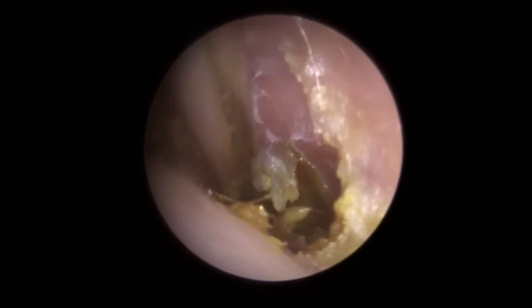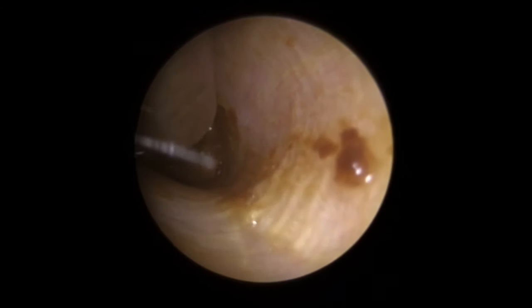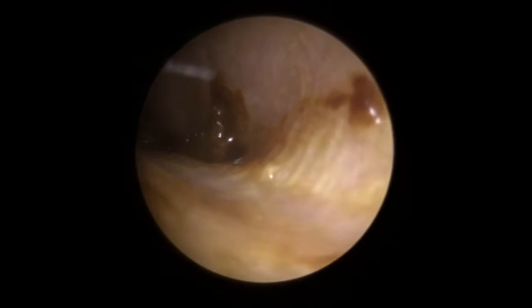The patient was very, very shocked to get that out. When we take a look in there, we can actually see the back portion had gone all the way down from the front of the canal right the way down to the eardrum. So I've popped a little bit of olive oil in here — the patient was a little bit nervous, so it just helps that to slide away a little bit more easily without causing any discomfort. So we're going to slowly creep down to this last piece of wax now using the Zollner tube, just staying slightly away. We've just got a grip — there we are. You can see it all peel away — this was actually pushed right up against the eardrum. So no wonder this poor gentleman was having so much difficulty, and no wonder it was quite tender to remove. You can see it was in the most sensitive part of the ear canal.